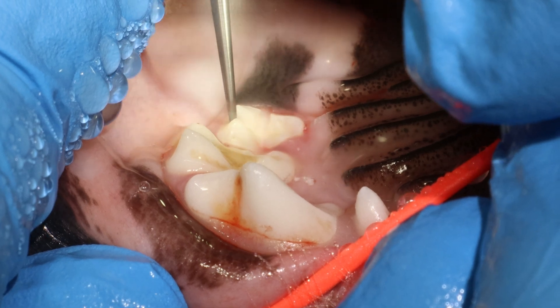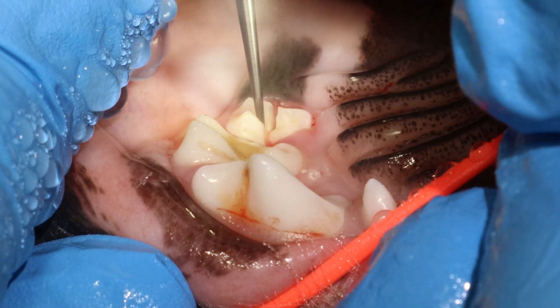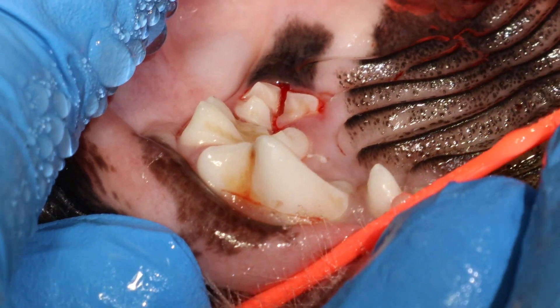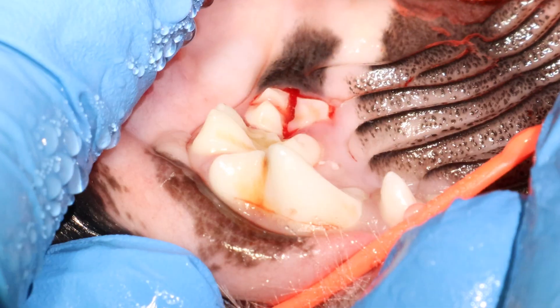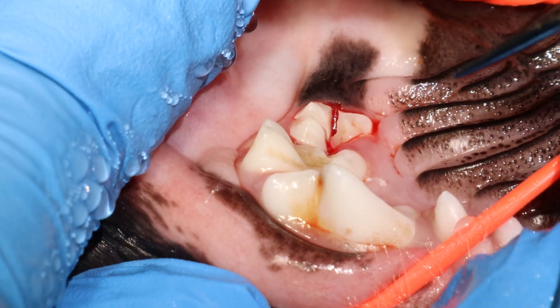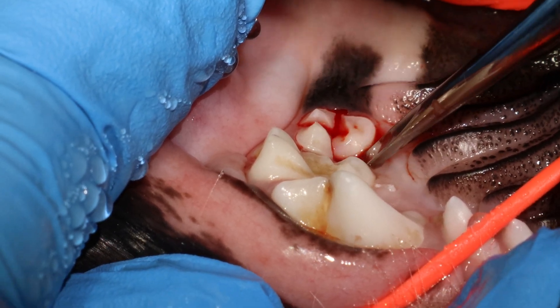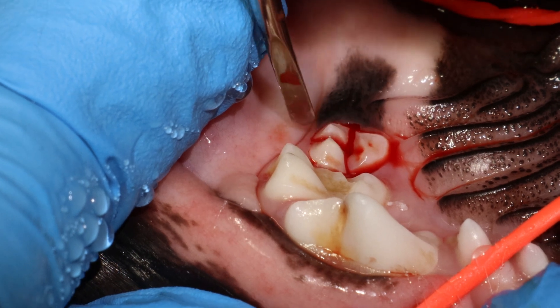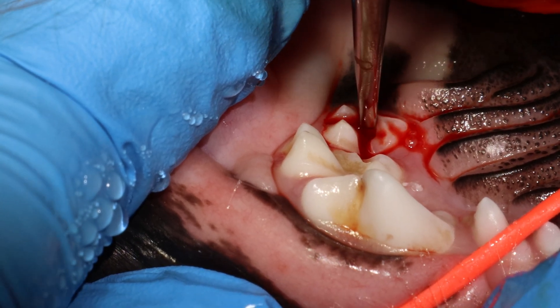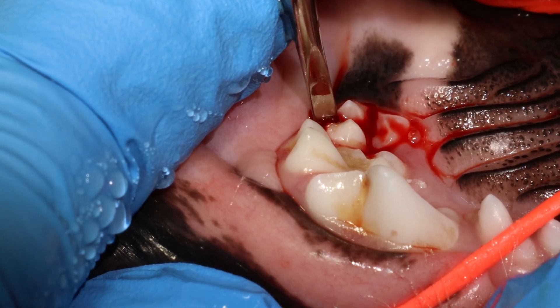Be careful you don't go into the gingiva. I like to keep just a little bit of tooth connection left at the buccal aspect, and you can later go in and just fracture it with your luxator if they're still a little bit attached. In this case the roots are fairly simple to get out individually, but if I tried in a normal instance to get this tooth out by just pulling the whole thing out, the buccal roots would most definitely fracture, and that would be very complicated to go back in and retrieve.